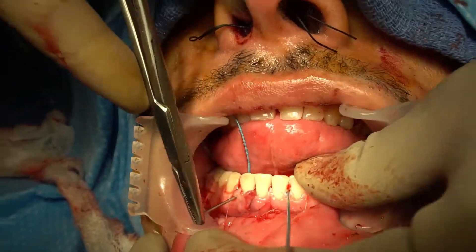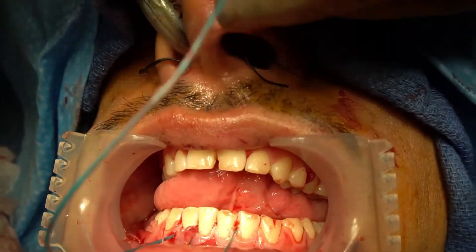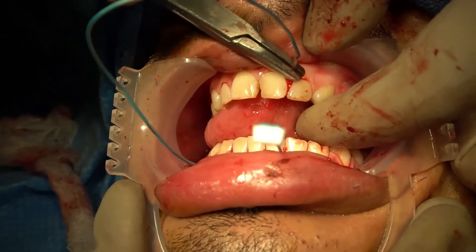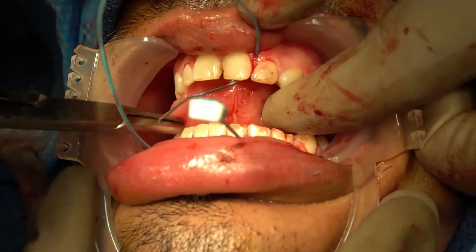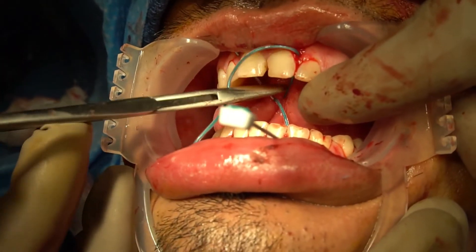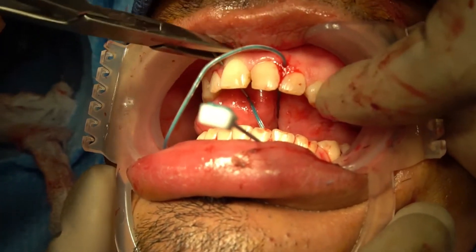Cross diagonally across the front of the teeth and insert into the embrasure space in the maxilla directly above the first, from buccal to lingual. Cross laterally behind the upper set of dentition and exit through another maxillary embrasure, typically two to three spaces from the previous.